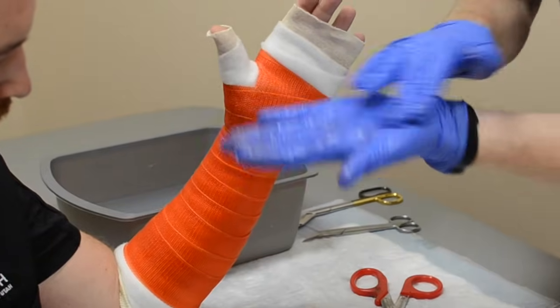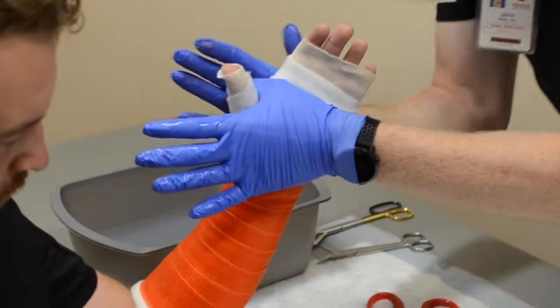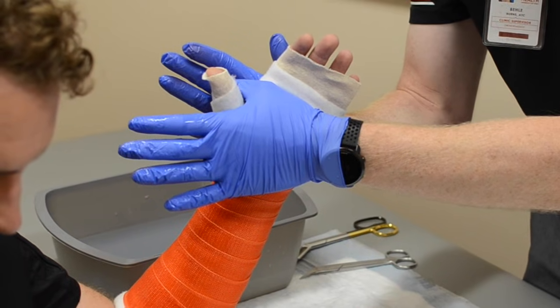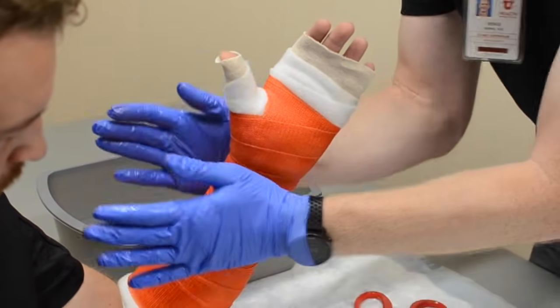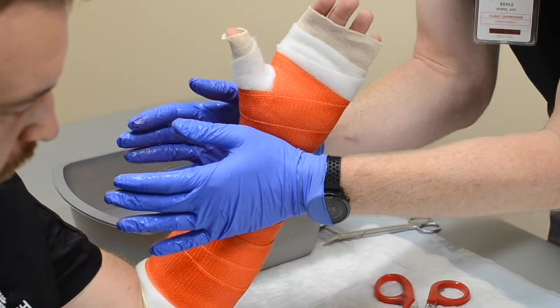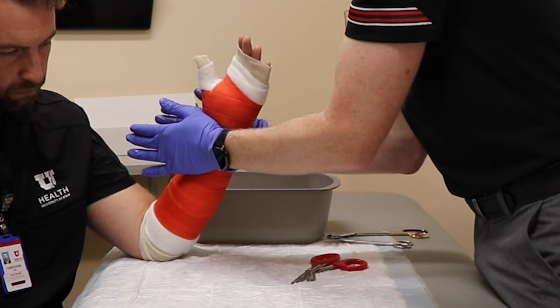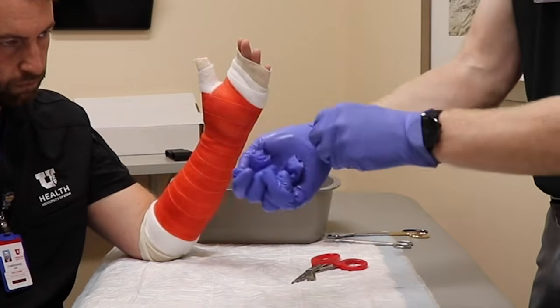I'm going to use my thenar eminence right into the palm. Put a little pressure in front and back of the hand to form the cast. Typically for a patient, I'll hold it for about 60 seconds to make sure that this forms against his skin. And then I'll do the same thing around the wrist — just slight pressure so that I'm only holding the cast material up against his skin, not pushing in. Again, about 60 seconds there. And we'll go to round two.